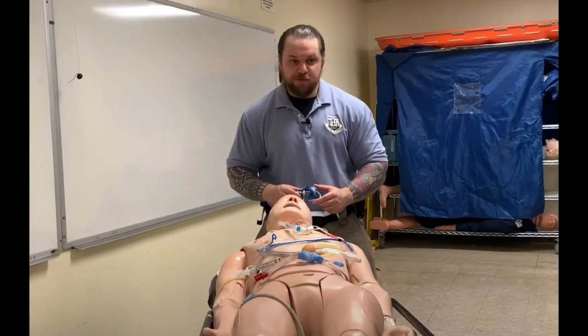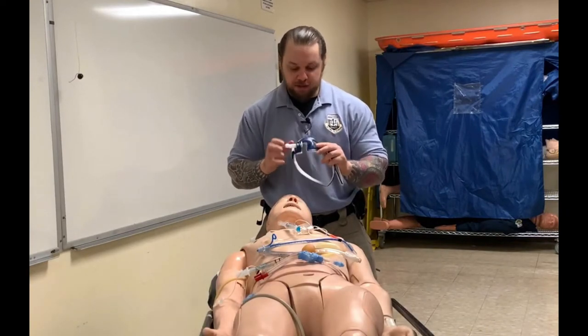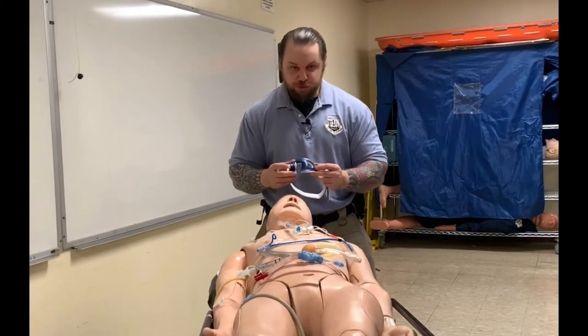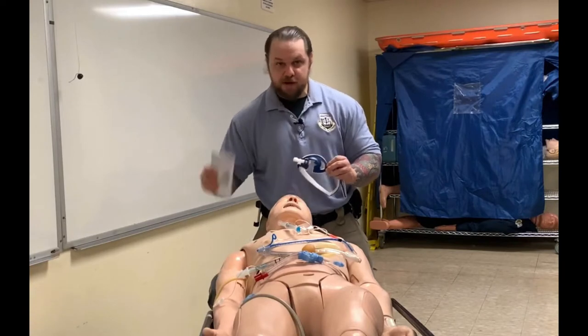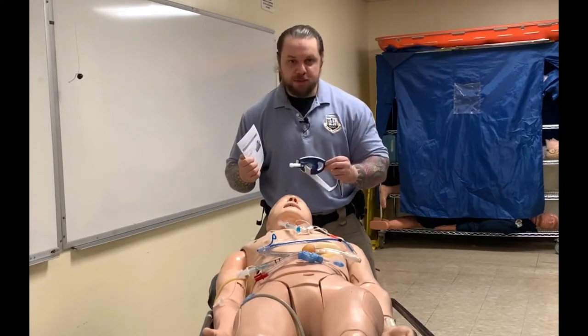Hello, my name is Nikolai Yusupov, and in this video I'd like to show you how to place the Thomas tube holder correctly. In my hand I'm holding a Thomas tube holder made by Laerdal, and far too often I see this placed inappropriately — and oftentimes demonstrated incorrectly on YouTube.